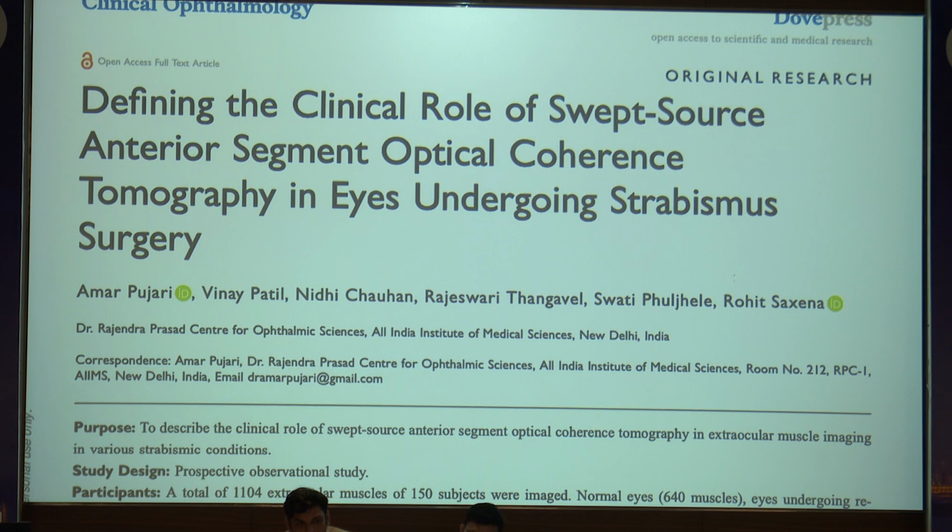And in future, there is one article in PLOS, a Japanese study. They have done AS-OCT imaging. They are going to take 10,000 scans, and the machine artificially predicts the hypoechoic area, the muscle. So that is able to create a virtual image of the fleshy part on the sclera itself. So you are going to take a snap and say that the muscle is probably here. So that's how the technology is going to change. But as of now, we are here, right?